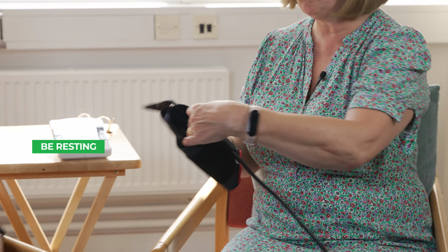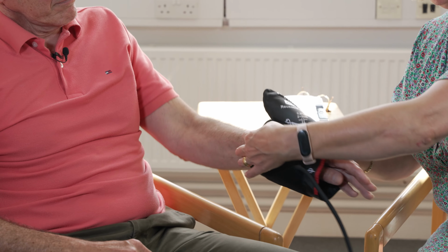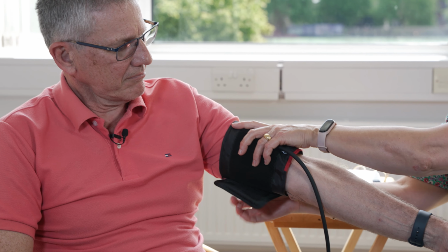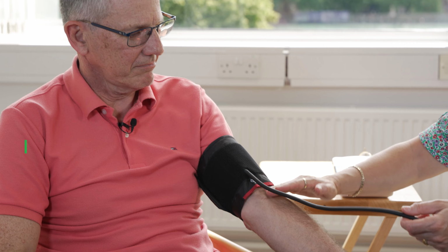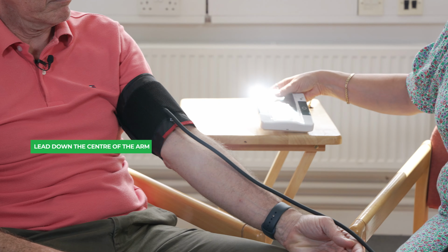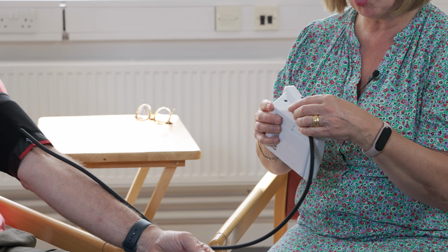So normally what I would do is ask someone to rest before their blood pressure is taken. And pop the cuff on, put it to the top of your arm, and this is about 1 inch from the top of your arm and 1 inch to the crook of the arm, and the lead goes down the centre. The monitor, always make sure that there are good batteries in there.